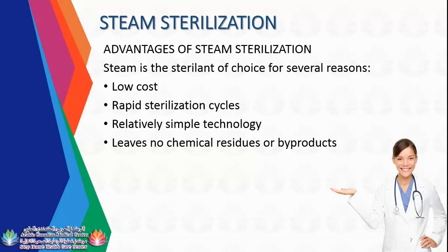Unlike ethylene oxide, where there is ethylene gas placed in a canister. Then a rapid sterilization cycle, because the sterilization will be finished in 40 minutes, while ethylene oxide, for example, will finish in 8 to 12 hours.